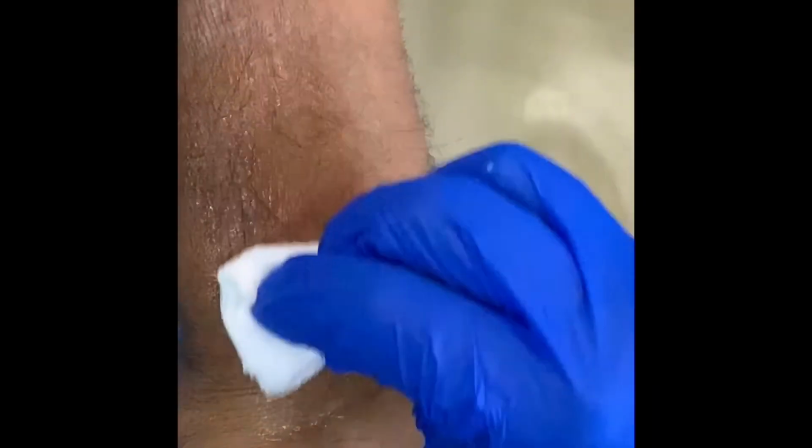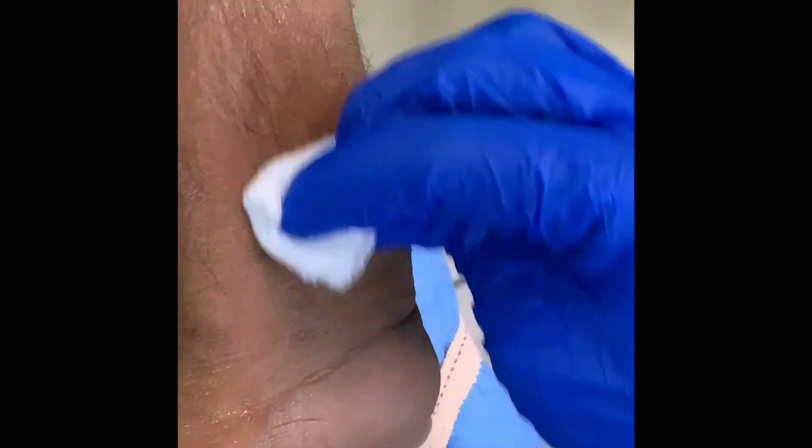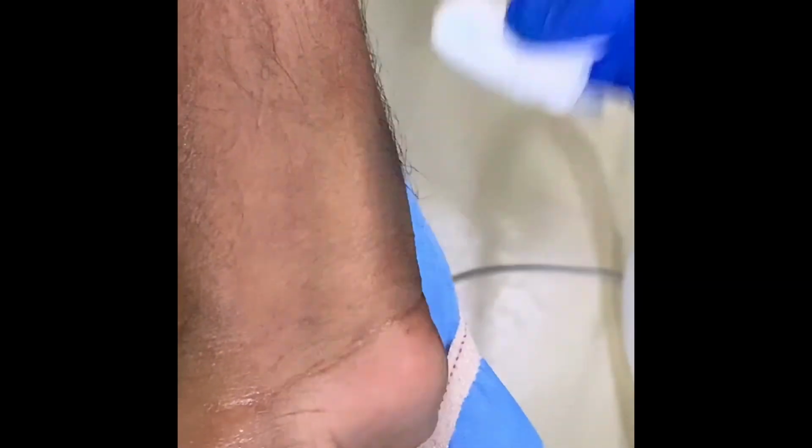Some of the troubleshootings which we generally see when we insert an arterial line would be puncturing the artery but not being able to cannulate the artery. Now generally we use the counter puncture method, which is shown in this video also, wherein the artery is punctured at an angle and then we decrease the angle further a bit and go some more in.